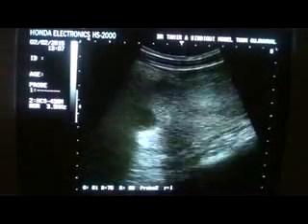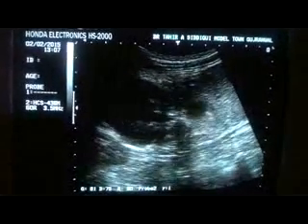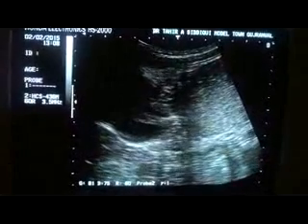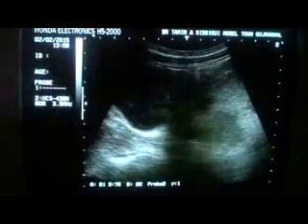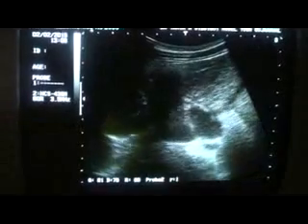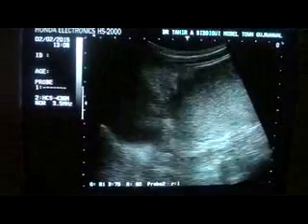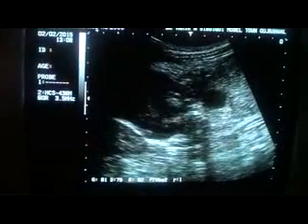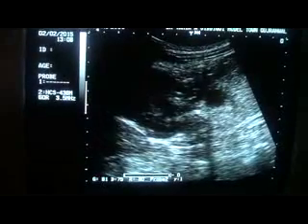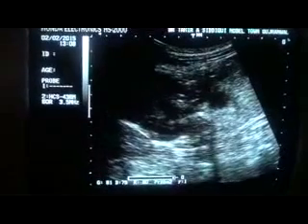This view I am getting from the right lateral location, from the lumbar region. I move the probe upwards and then I get this area. So this is a case of intestinal obstruction with impending peritonitis, and the most probable cause can be Koch's infection.